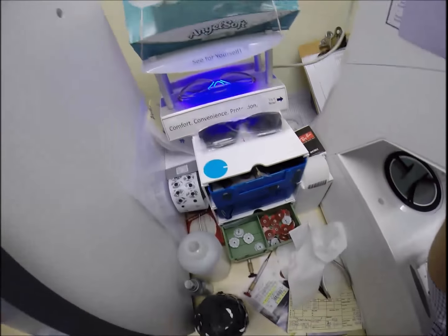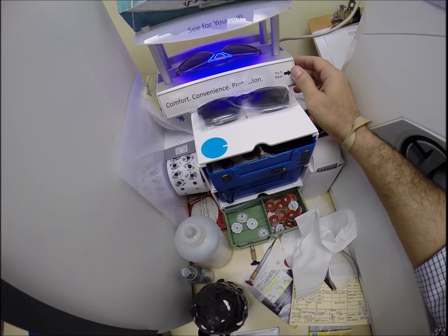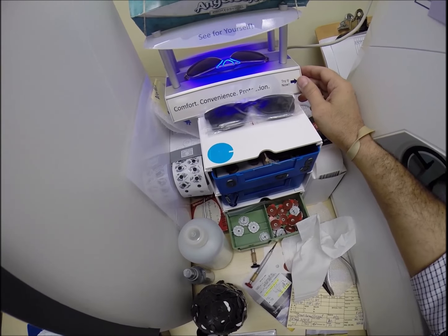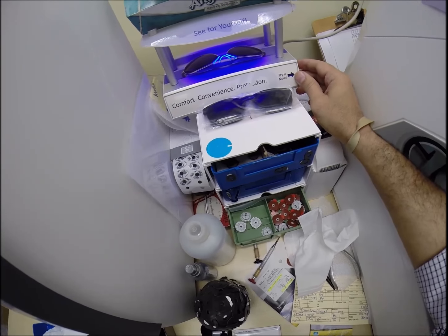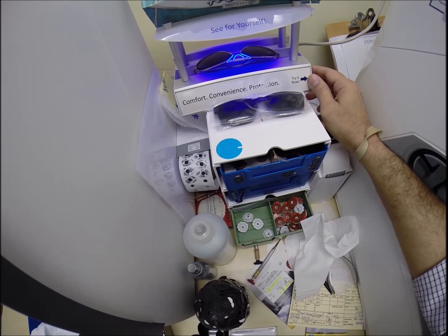And as you can see, it takes about 30 to 45 seconds for transition lenses to darken. It takes a little bit longer when you come back inside. 45 seconds to roughly about a minute 15 to return back to virtually clear. Now, hey Zeus, this is important. Pay attention. All transition lenses will turn dark on day 1. They're going to continue to darken every day for the first 2 weeks they're exposed to the sun. After that, they will reach their final color and they will work for years at maximum performance.